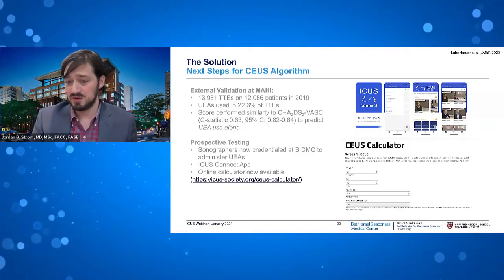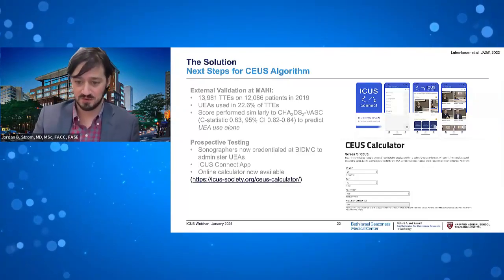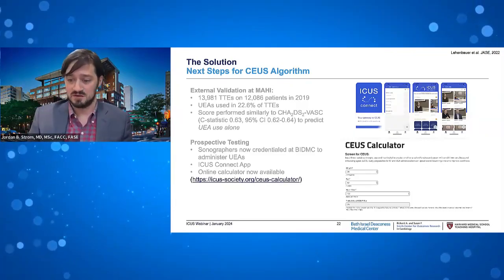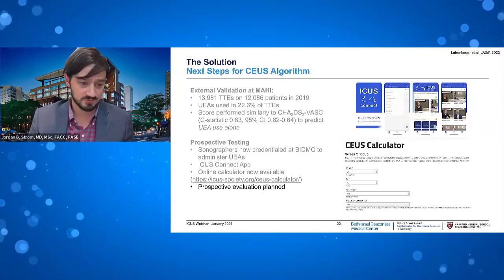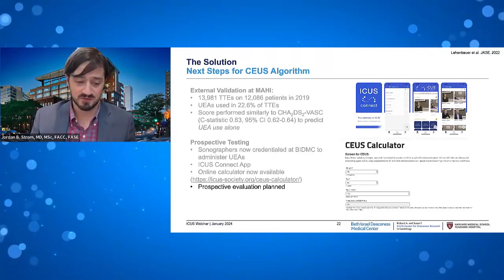And what we say is that if the probability is greater than 15%, then that's the inflection point. That's when you really should be considering the use of an IV to support contrast, with the final decision to give contrast ultimately based on the review of the images. We're studying this prospectively, and we hope that this will ultimately make a big difference in care.